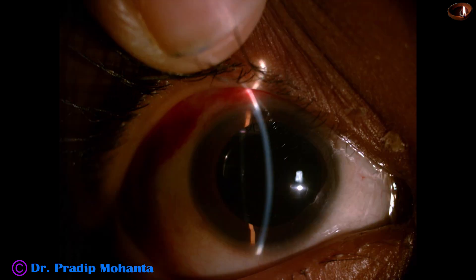The post-operative pictures show the cornea is clear and the anterior chamber is quiet. The patient is doing very well. Thank you very much for your attention. I hope this video will help you in developing your surgical skills. Be a great surgeon and serve your patients with love, respect, compassion, and great surgical competence.